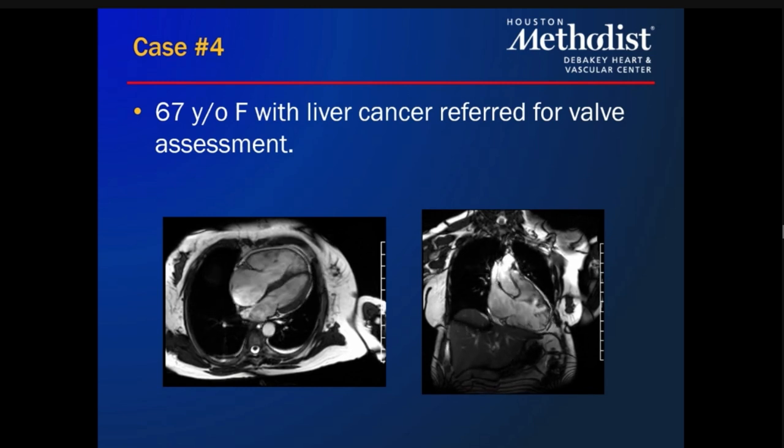What's the mechanism of the tricuspid regurg? Yes, George just commented. He said it's rip roaring. Yes, but the mechanism of it. Are you there, George? Yes, I'm here. And on the question of the mechanism of the TR, I think there's some annular dilation for one thing. With the enlarged RV, I think that would be one. That's the etiology, I would suspect. Okay.